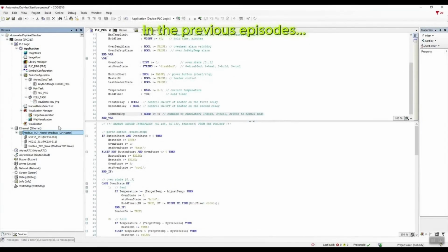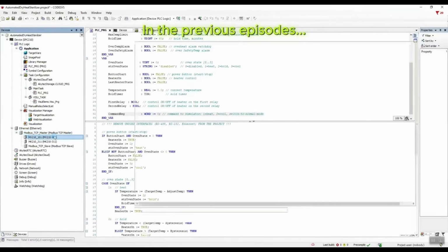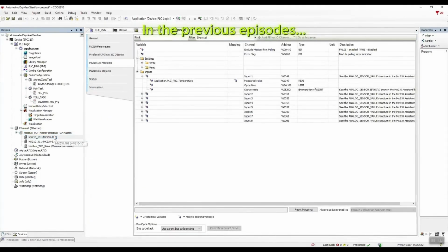This template, developed by akYtec, frees the user from needing to know what Modbus is. In other words, you don't have to spend time studying documentation and the module's register map, and you won't have to think about how to properly configure numerous parameters to form requests, or rearrange registers to get correct data and convert them to the required types.